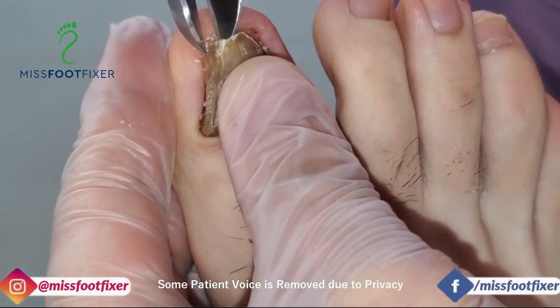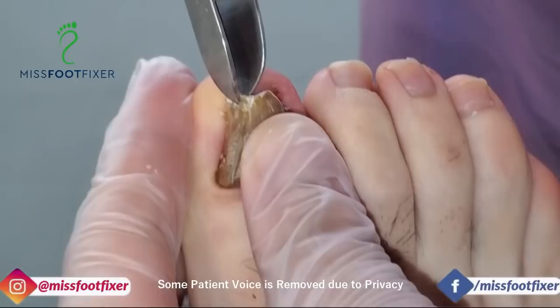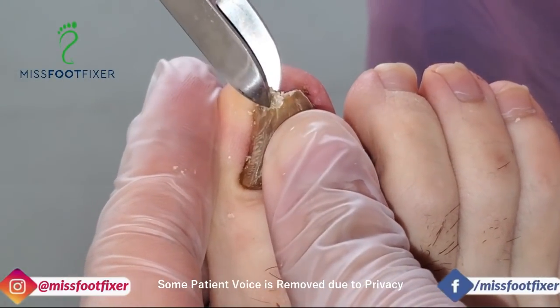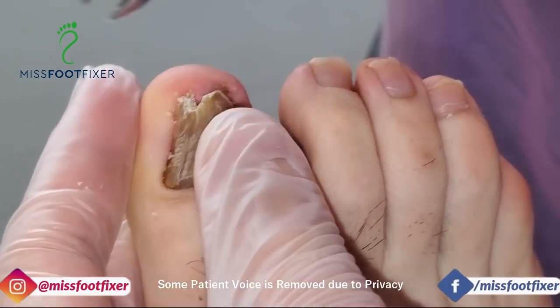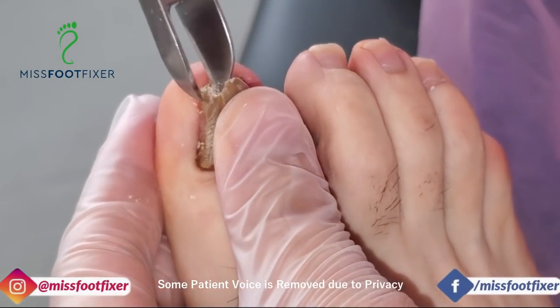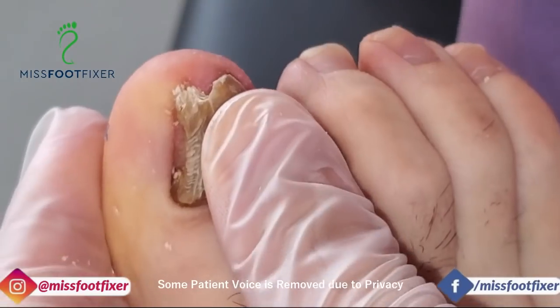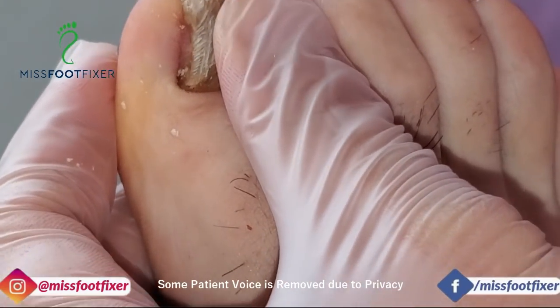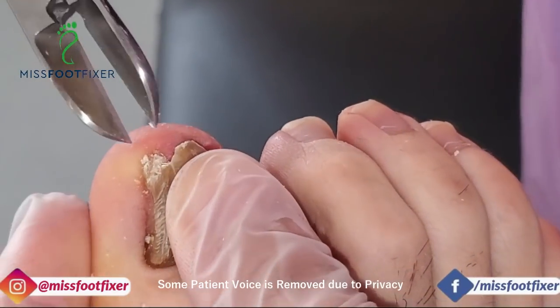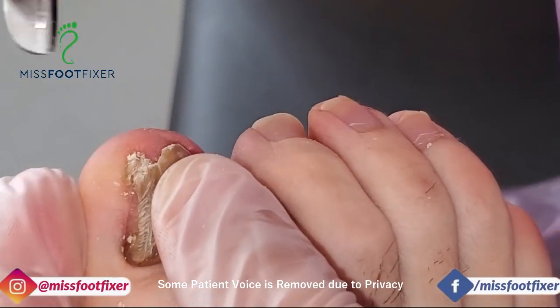So it's not the size. You just have to do it bit by bit, because if it wasn't that painful, we could just go in and grab it, but because it's so sensitive, we just need to be really careful with it. So there we go. Dr. Kenny is just really taking chunks off bit by bit. Good. I'm doing things at angles so that it breaks off.